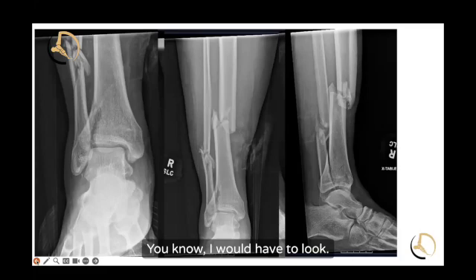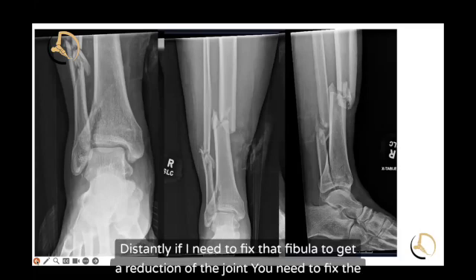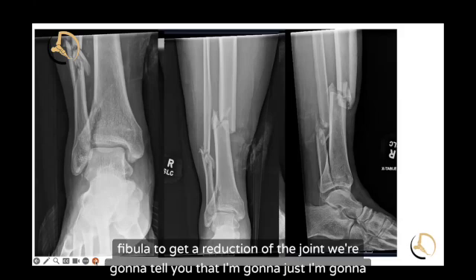You need to look distally — you need to fix the fibula to get a reduction of the joint. That is the correct answer.